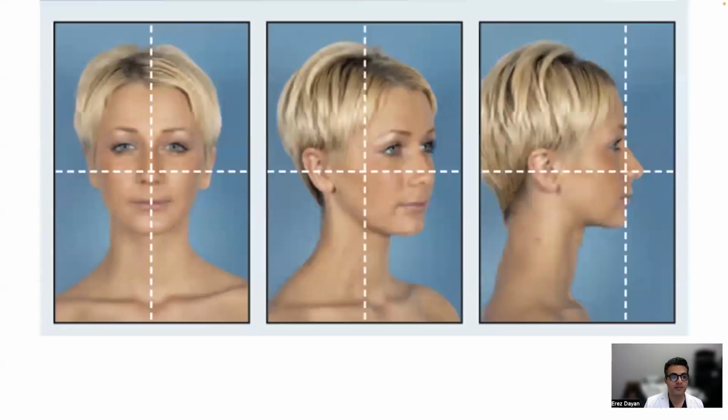If we're performing neck liposuction, similar idea. We want to get an AP view, 45, and then lateral.